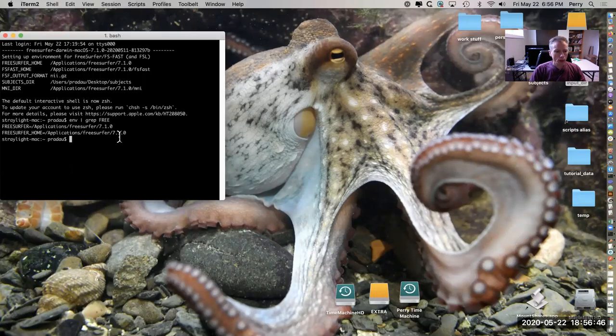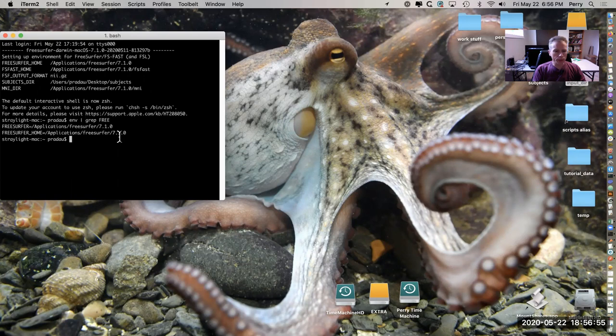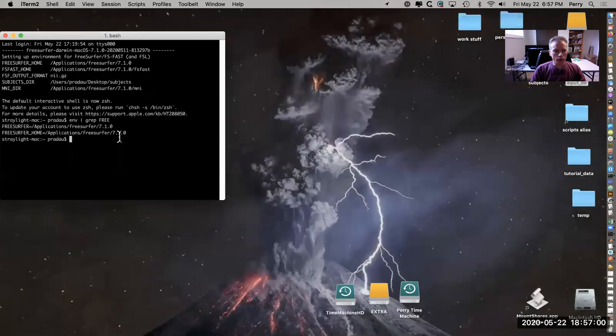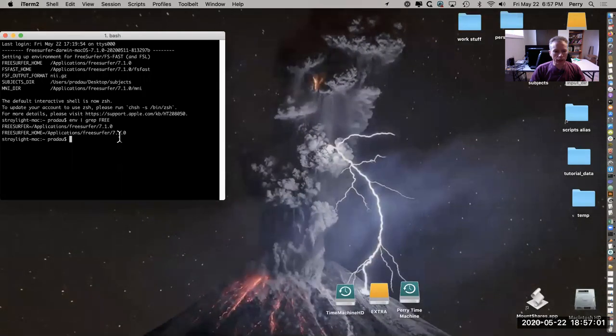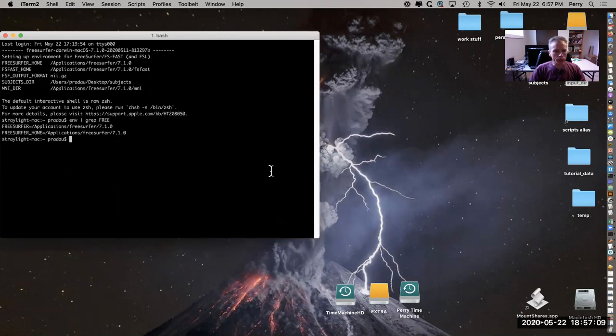What I want to demonstrate in this tutorial is the use of recon-all. Recon-all is a way to be able to do all the steps from the raw data to extracting the brain and segmenting it and finding the surfaces. This is probably the most common command that you'll use FreeSurfer for.